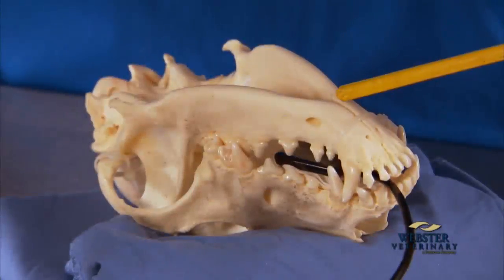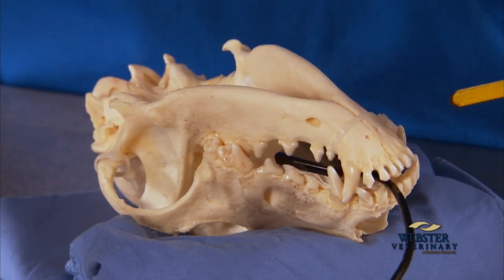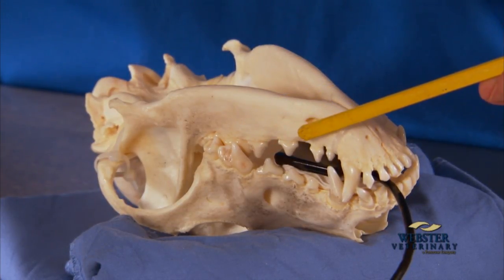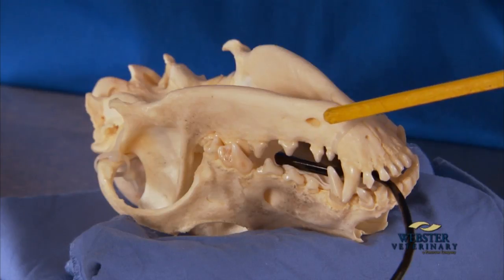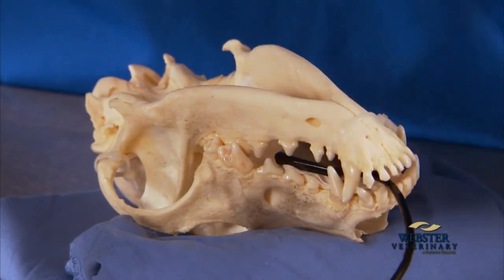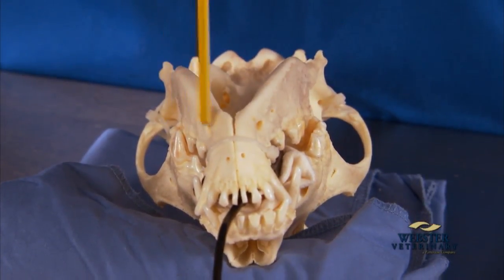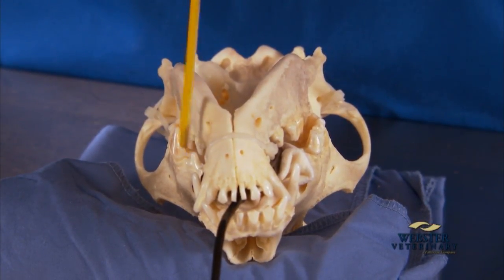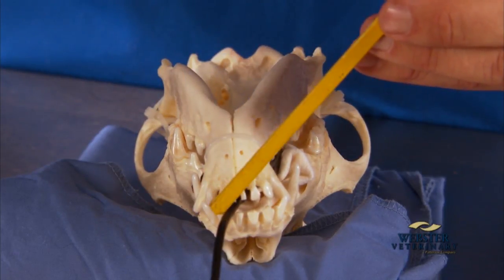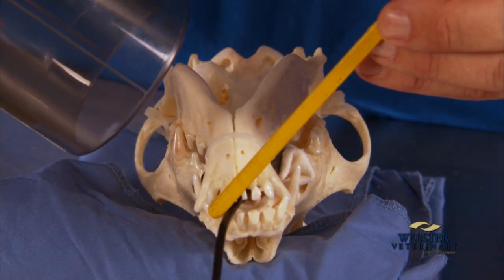The mandibular symphysis prevents parallel placement of the sensor in the rostral mandible to image the first, second, and third premolar. So therefore, the sensor is placed into the oral cavity in this plane. The plane of the teeth is in this plane. The bisecting angle, therefore, is in this plane, and the tube head is moved to achieve the image.